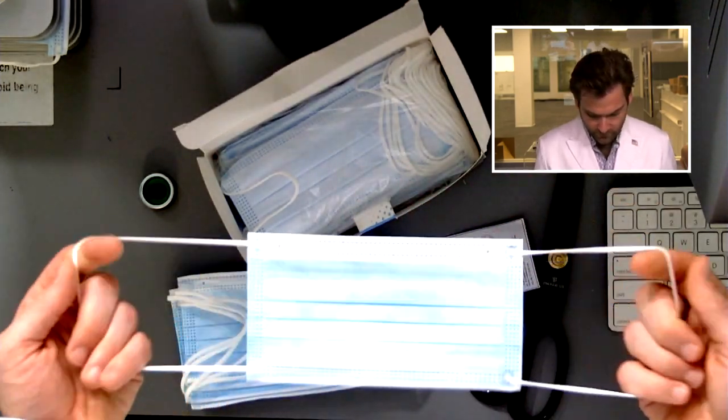I like the ear loops they're using — they look really high quality. And I would expect high quality from a manufacturer that bothered to go through the FDA clearance process. It can cost hundreds of thousands of dollars and take years to go through the clearance process.